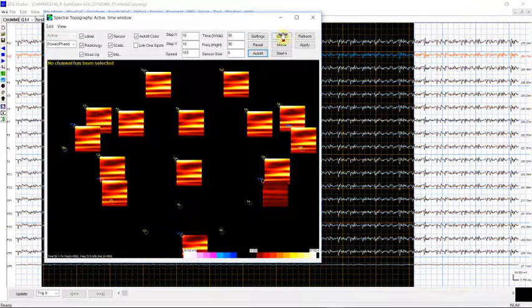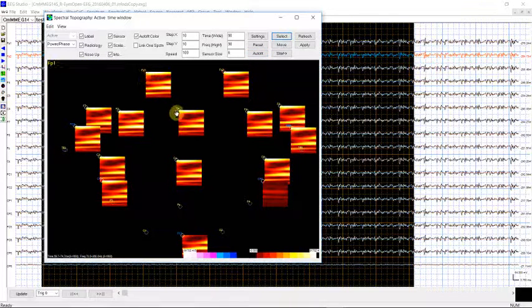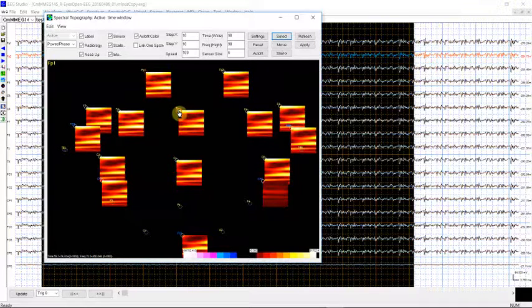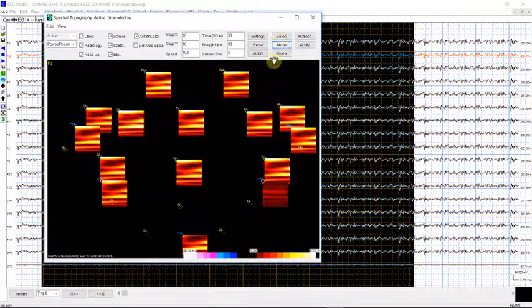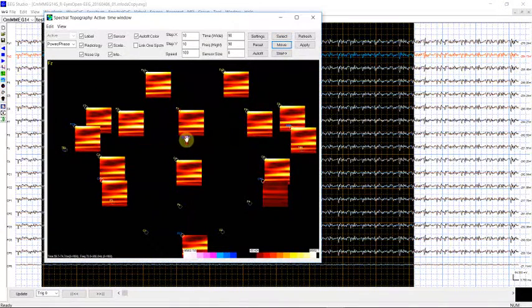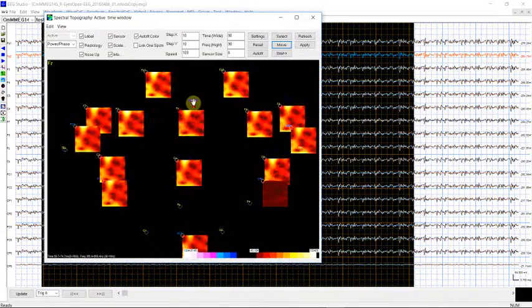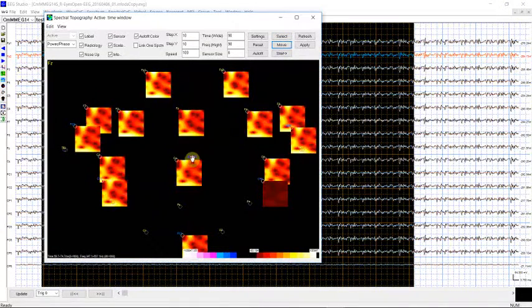If you click the set, then you can select each channel. As you can see, once you select them, here it will show you which channel you selected. You can move them, move up, move down.